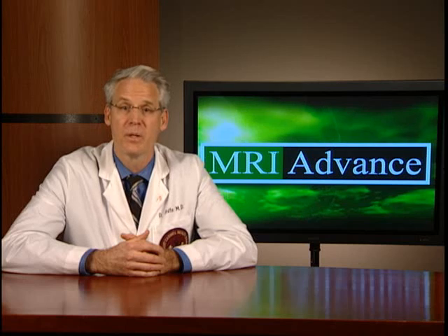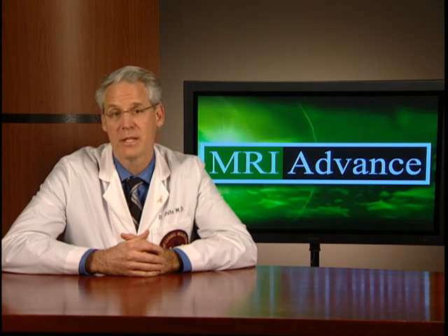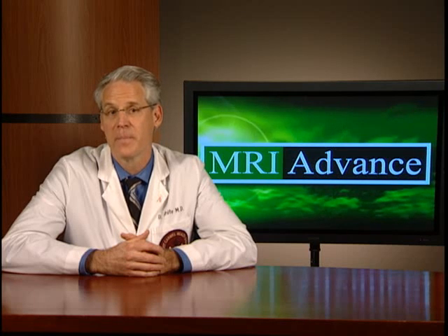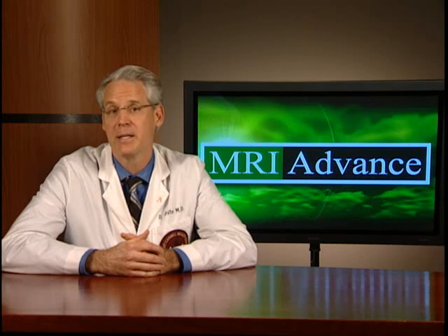In conclusion, when beginning your breast MRI program, be sure to establish a defined approach to scheduling your patient to assure that appropriate patients are imaged and, when possible, at the most optimal phase of their menstrual cycle. This, in turn, will improve the quality of the final exam and interpretation.